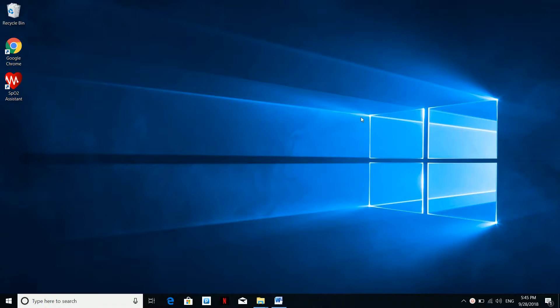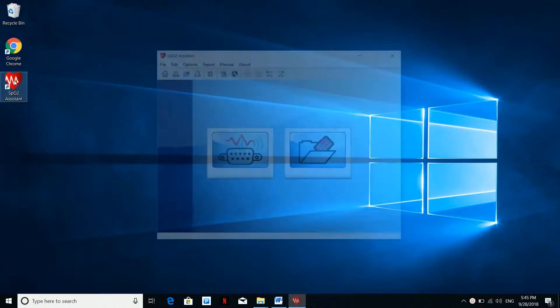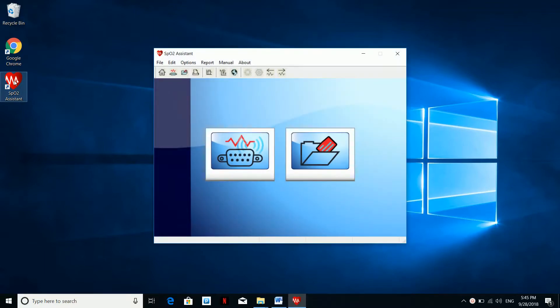Open the SPO2 assistant by clicking the red heart icon. In the software homepage, you will see an icon to connect the device. Click on that.